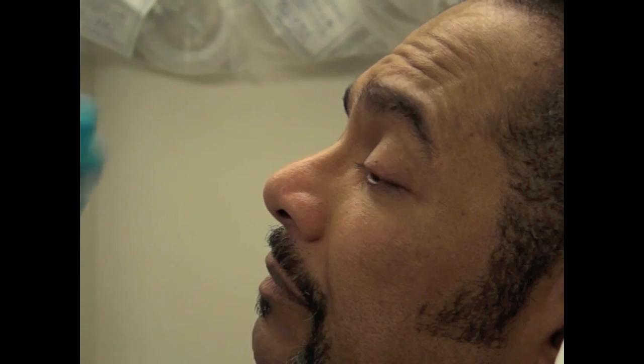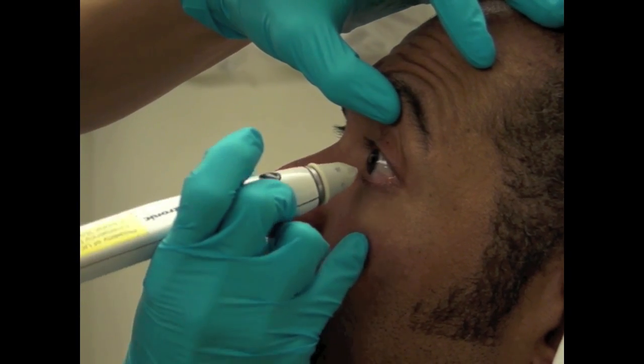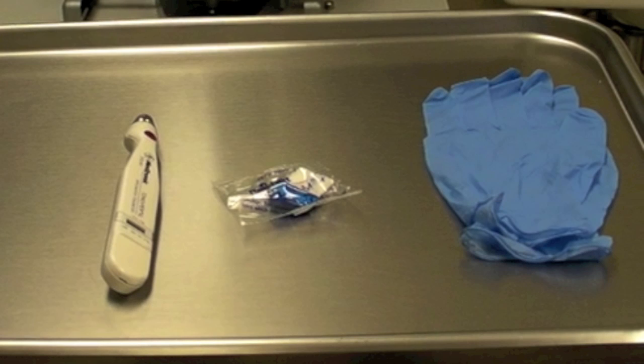Tonometry should certainly not be performed in a patient with suspected penetrating ocular injury as it could further extrude intraocular contents. It's important to get all of your materials together. This includes gloves, the portable electronic tonometer, and the replacement tips.